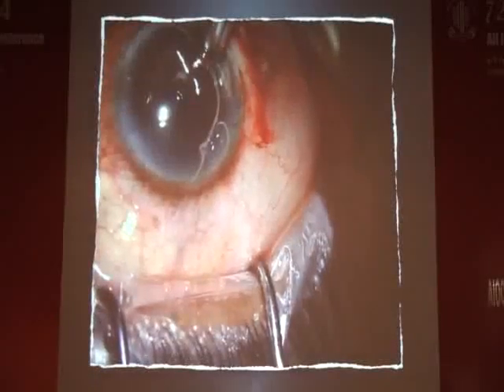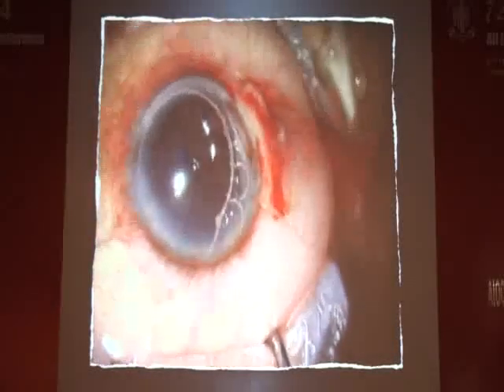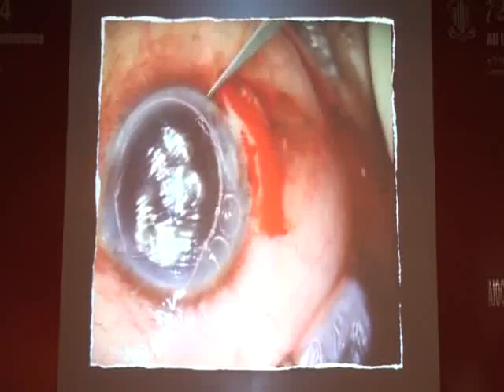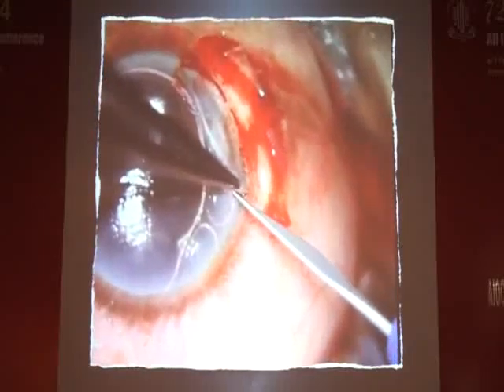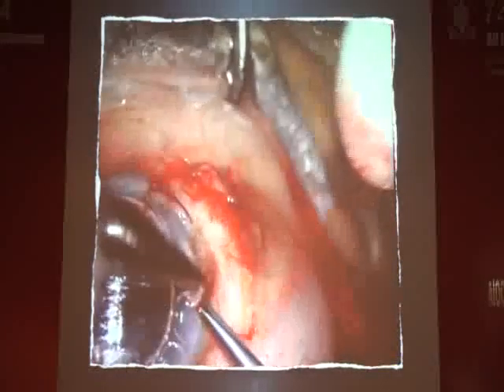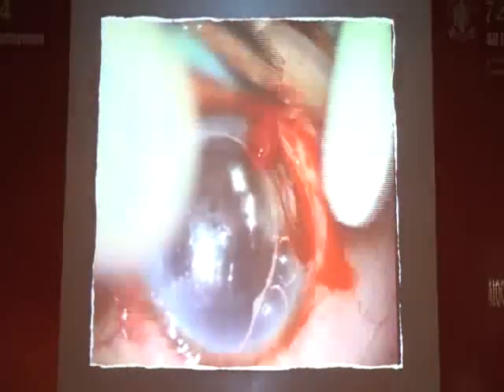And the idea is to get curved outlines so that you can then match them more precisely, although you could, I guess, do it with freehand cuts as well. It will become much harder to match the tissues there. So this is the curve on the outside of the mark made by a dermatological trephine, and you want to go right and deep, get the plane of dissection here, get about 90% ideally, because you don't want your graft to stick up outside its bed, and that's one of the most common reasons why these procedures don't work. You don't get a smooth surface on the anterior part.